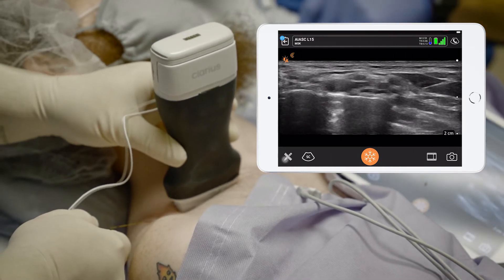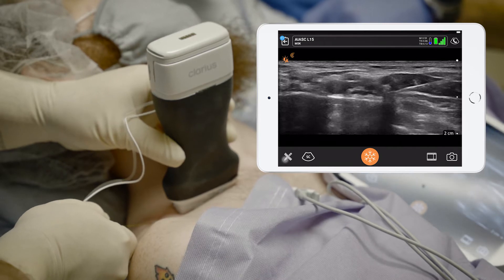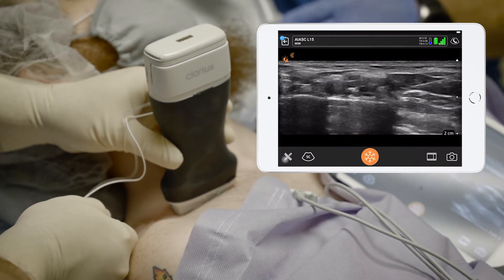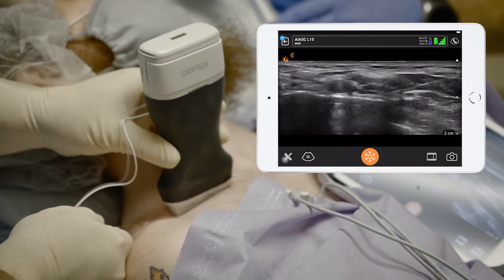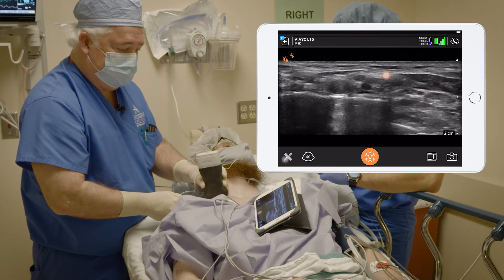Come in with our needle. Nice view of the needle coming in from lateral to medial. Going to go down to the first rib here. Rocky, go ahead and give me five and let's push these nerves up out of our way.